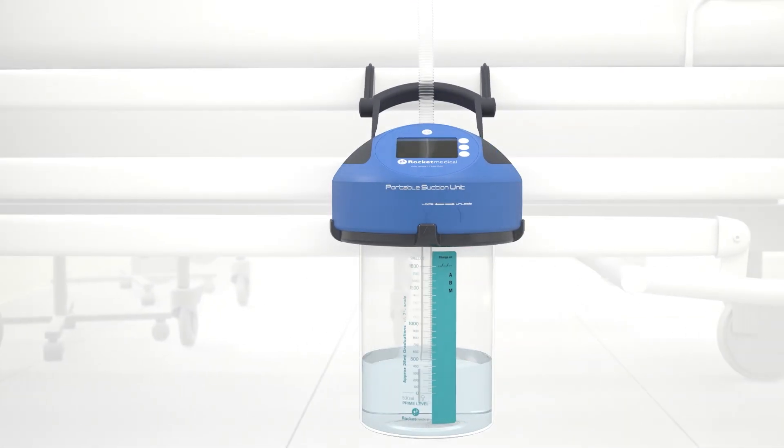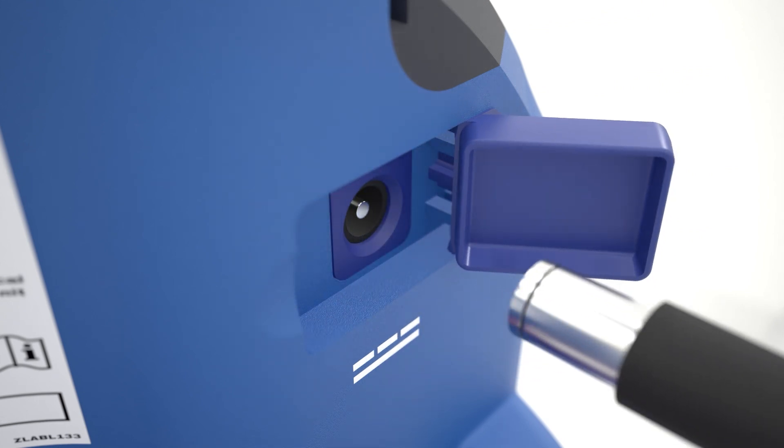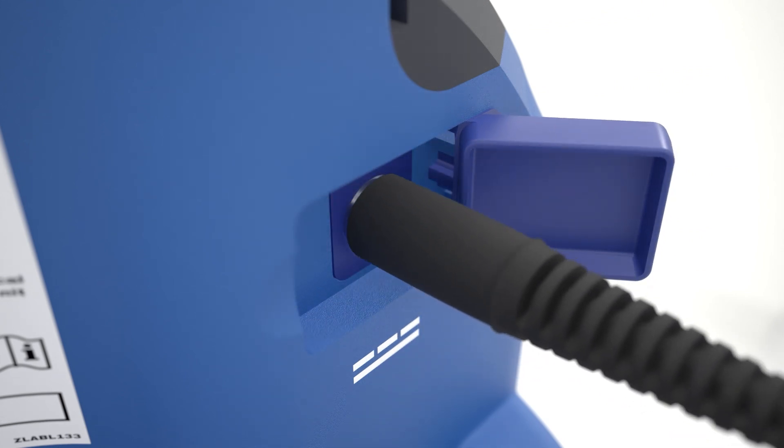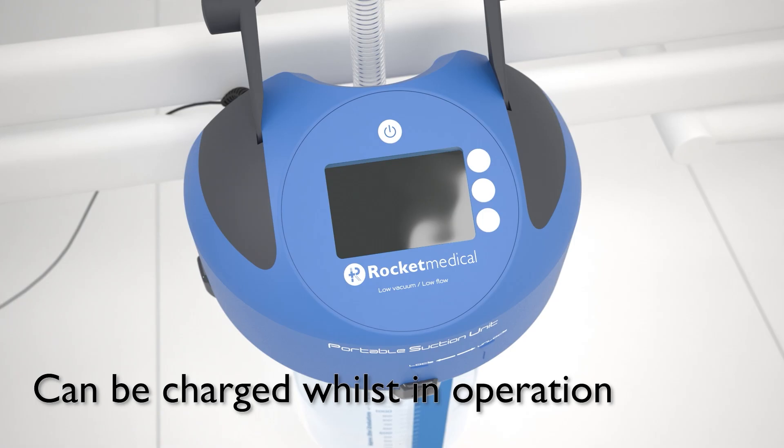The PSU has a rechargeable battery to enable patient mobility. If the PSU requires charging, connect the power supply cable to the port on the rear of the device. The battery takes at least two hours to charge and will last for a minimum of four hours.